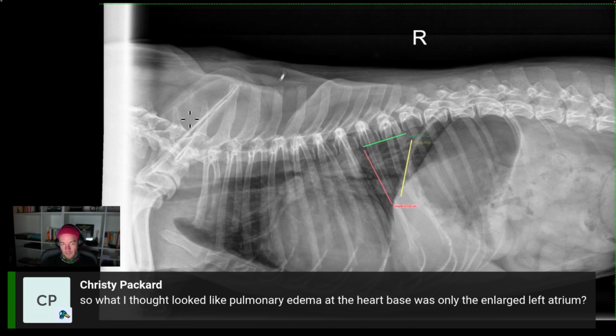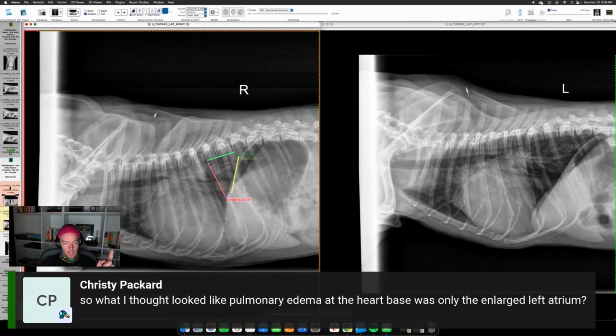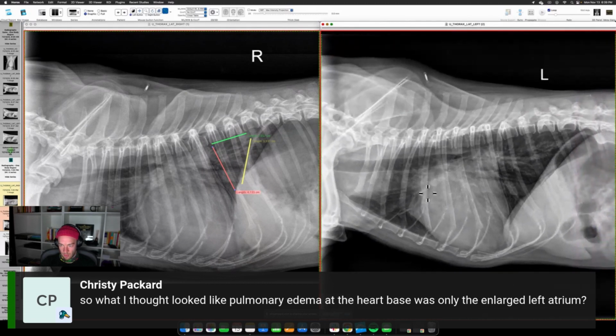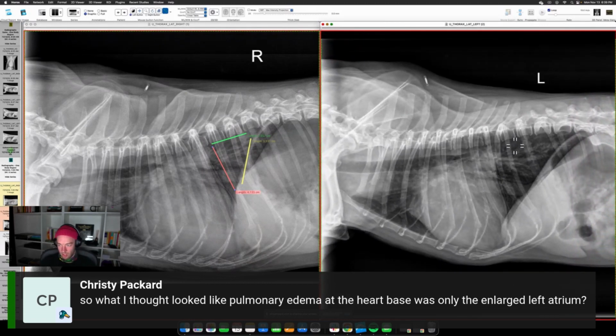That's really opaque. And then you go, well, wait a minute. Okay, maybe that opacity is just the expiratory phase of respiration. That bullshit that radiologists put in there to not be helpful. But it's real, because look at this dog. This view is taking a really good breath. This piece of pizza, this is your piece of pie right here. It's pretty big. This one down here is very small.